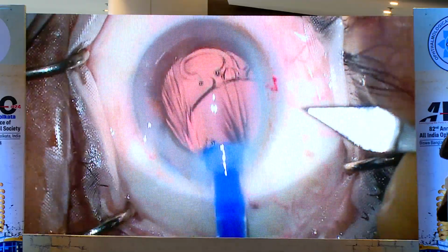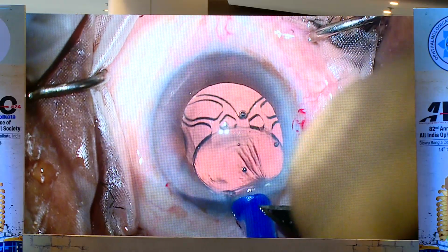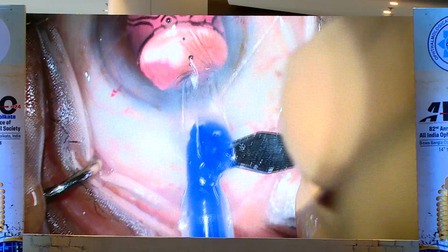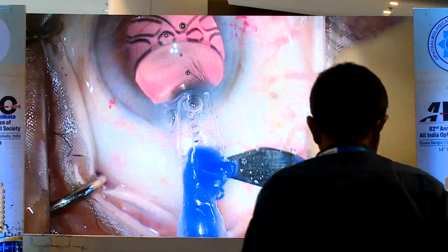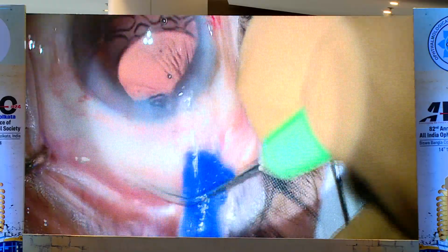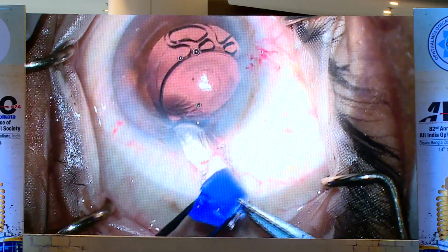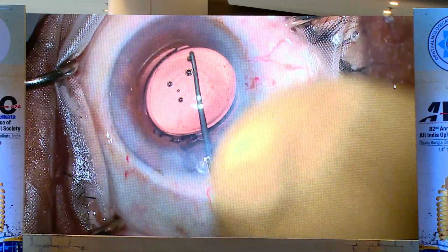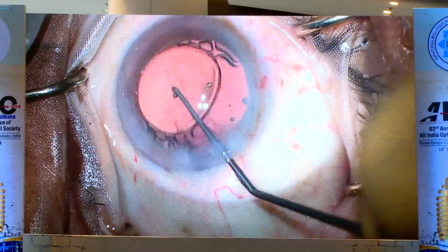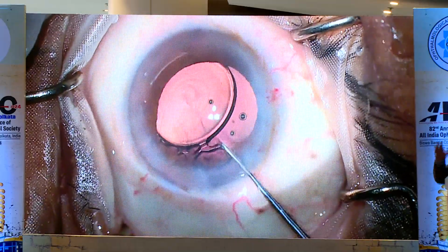So I thought I should make a little relaxing incision above the top of the injector. Even then I topped up the injector, but it is not going down or releasing, and the haptic is badly stuck. Then I cut the tip of the injector so that I can manage this. Even then I removed the plunger, and when I implanted the lens, I saw I had damaged one haptic. And you know, the Mini Well Proxa is a kind of trifocal lens, basically an EDOF lens. You need to have absolute centration.